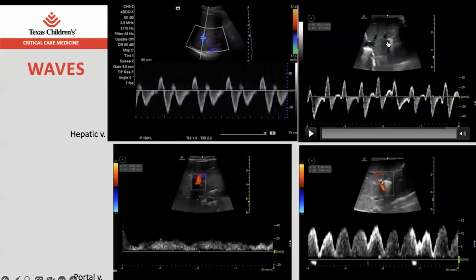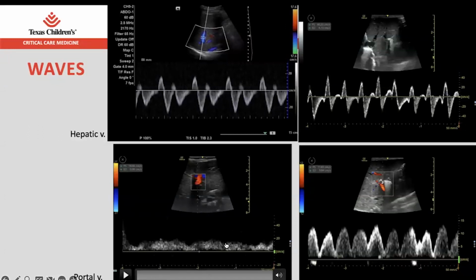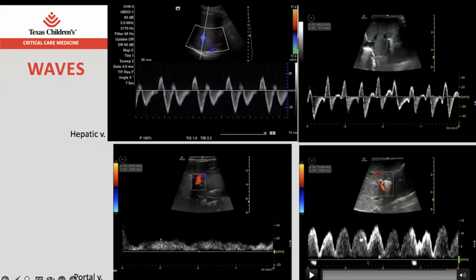Then here, as we look at someone who has worsening venous congestion, instead of this A-S-D type of orientation, we have S flipped in the wrong direction below D, so this would be a severe waveform change. In the portal vein, we change from a more continuous, venous-appearing flow, and we can see more notching of that as someone's liver congestion gets worse and worse.